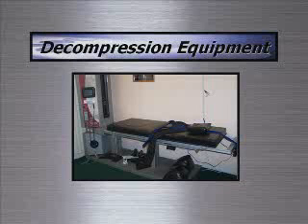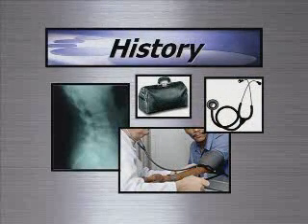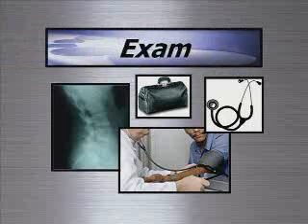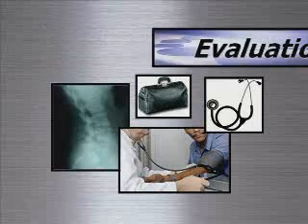Let's look at the spinal decompression procedure. On your first visit, we will take a detailed history of your case. Next, your doctor will perform a physical examination and evaluation to ensure that decompression therapy is safe and suitable for you and your condition. There are some cases where decompression therapy may be unsafe.